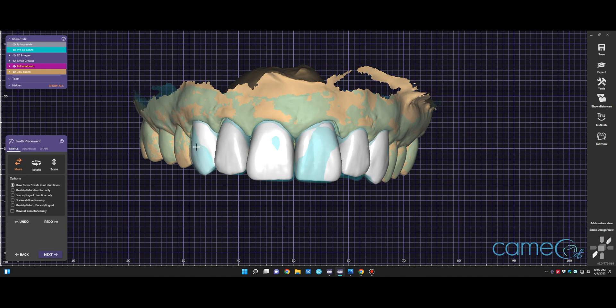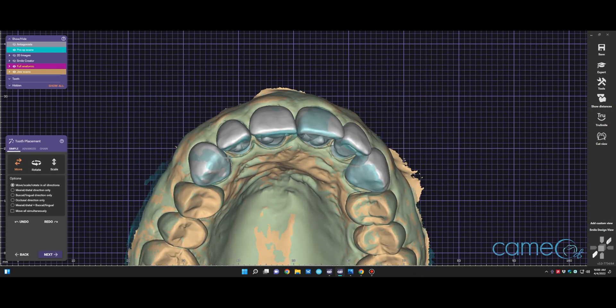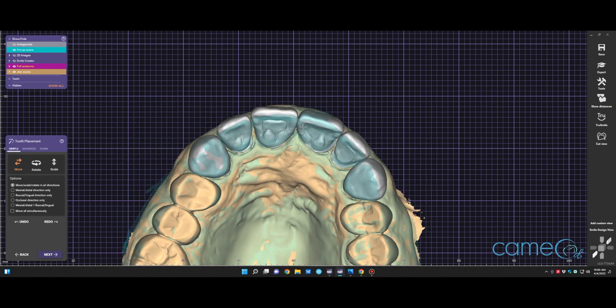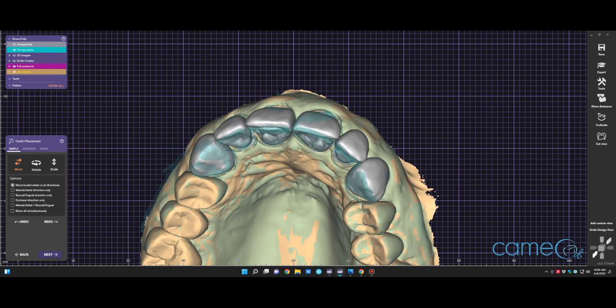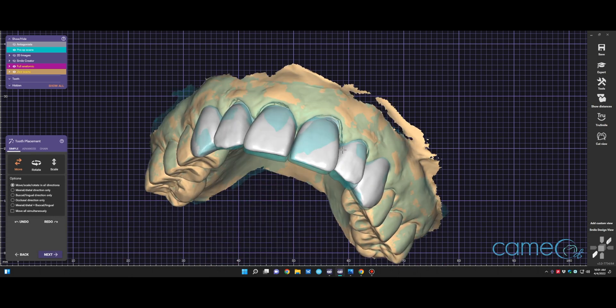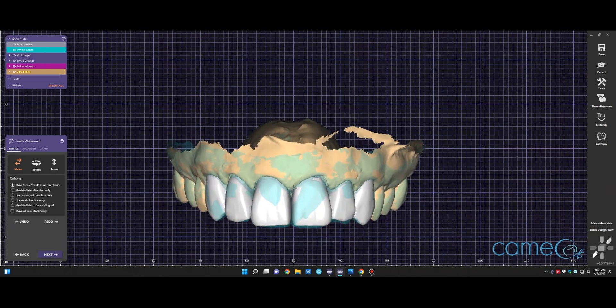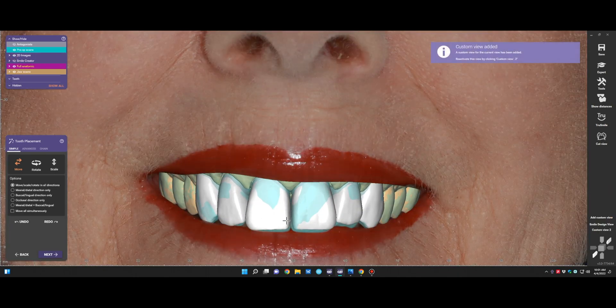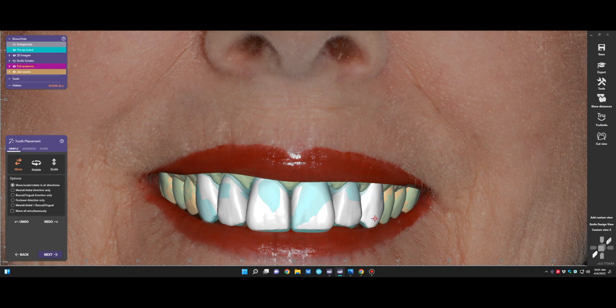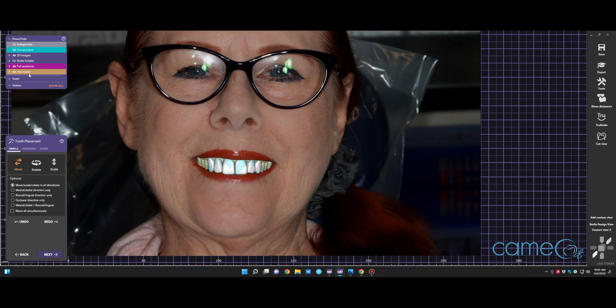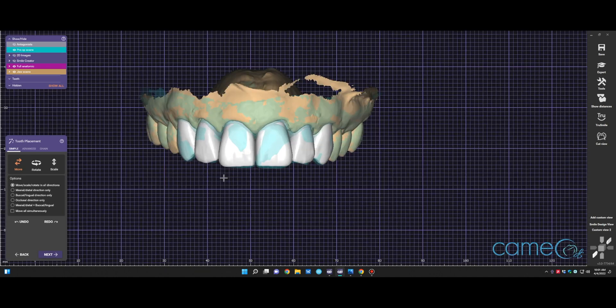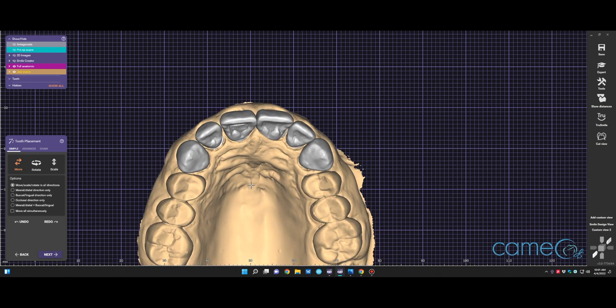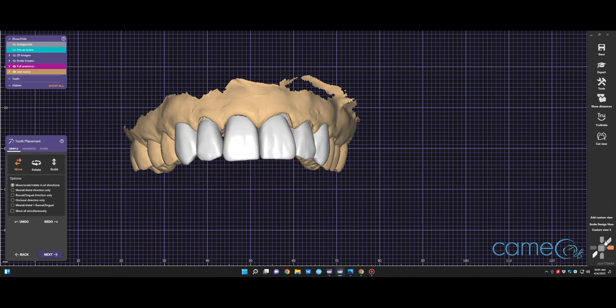At this point, we clicked on simple and now you will just manipulate the teeth until you feel like they're in the right position. Centering the teeth, the midline, the tooth support, the inclination, the angles, everything you think is ideal as you would like for this particular patient. You click on that smile design view and you can see what those teeth look like behind the 2D image. Again, once you feel like you're close there, then you'll click move on to the next step.